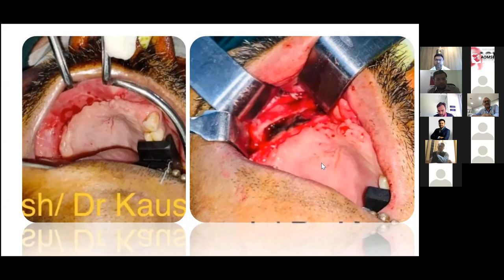So it is the same as fixing our plate. The only advantage here is you see only a small abutment coming out from that. But when it is near the midline, that design doesn't work. So that's the reason I would send another design where you just give support from the nasal area, the nasal area, where you just put three screws which are connected directly to the outer stud or the bar.